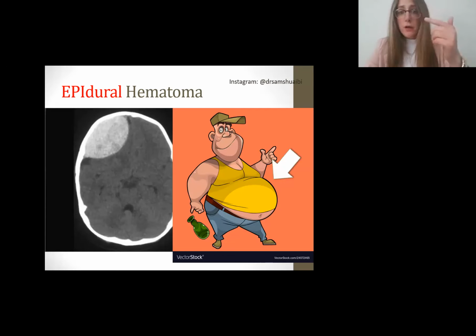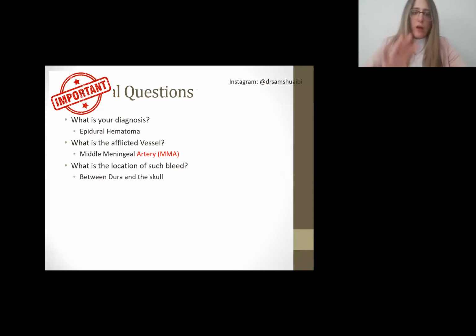If I were you, I'd take pictures of this as I go, and then tomorrow, anytime you have a 5-minute break, in the bus, going home, going out, just go through it, just like that. So these are high yield questions. I'm sorry, this picture is obscuring the question. Anyways, what is your diagnosis?